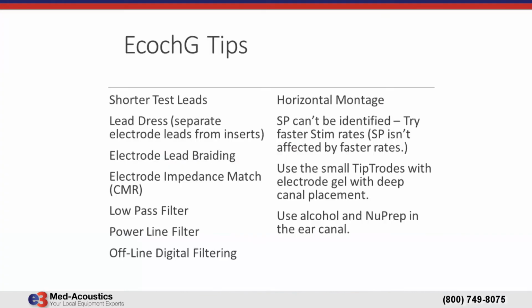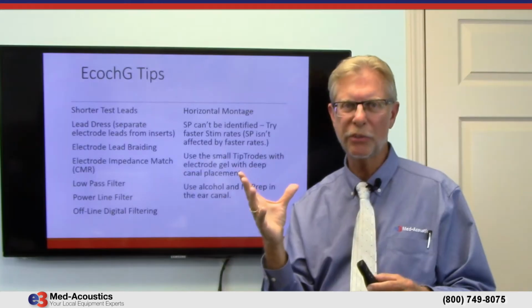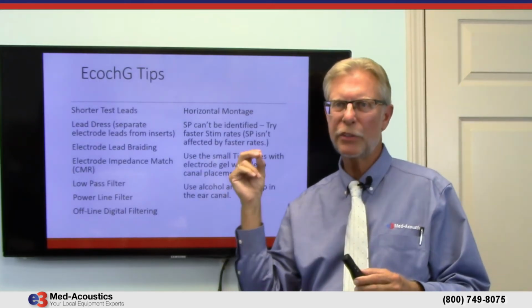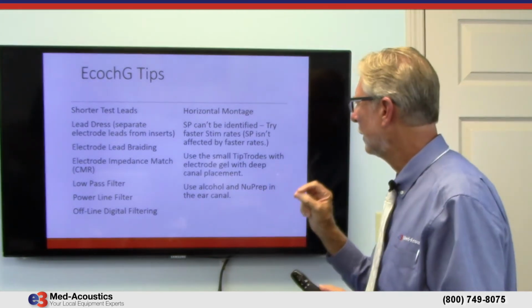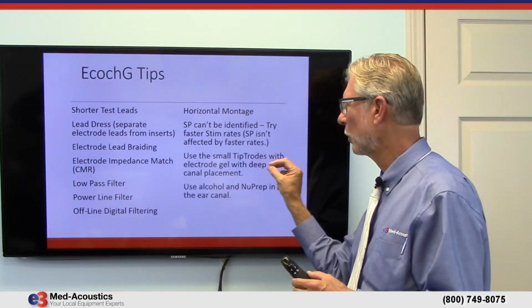Remember to use the smaller of the tiptrodes, what you would normally think was an insert earplug for pediatric. Even use those on most adults, unless they have a huge ear canal, so that you can get a very, very, very deep insertion. Don't be afraid of it. That's what makes all the difference in the world.